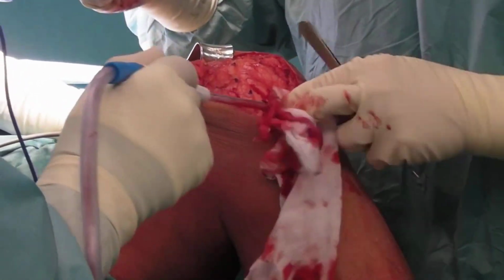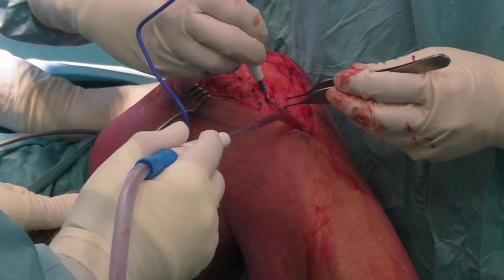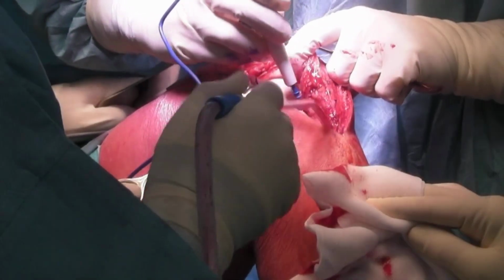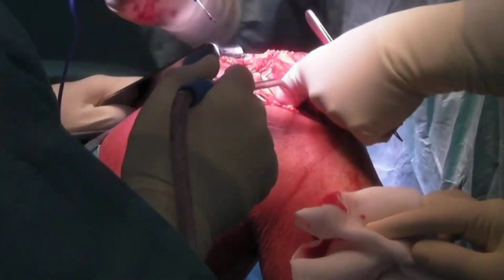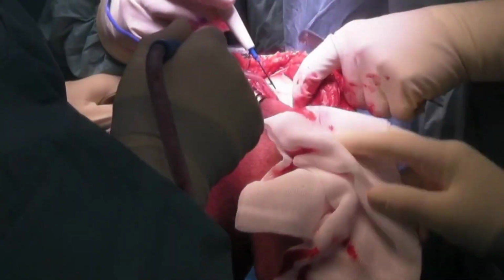The joint capsule must be cut so as to follow the inner edge of the patella without going beyond it. To do this, we once again use the electric scalpel, which cuts the tissue and coagulates the vessels, reducing bleeding.